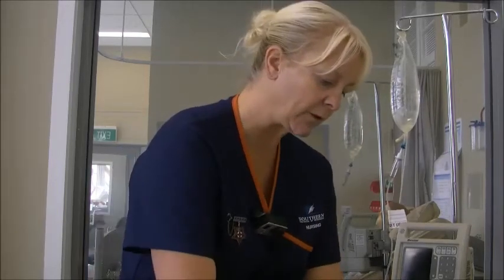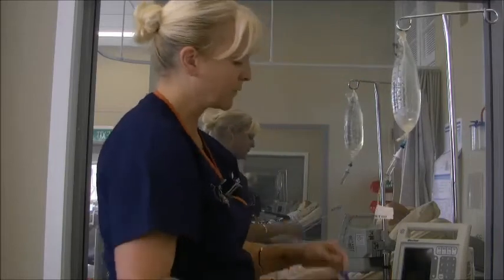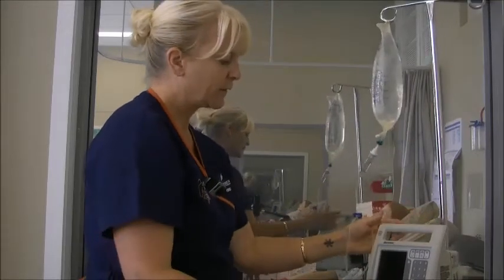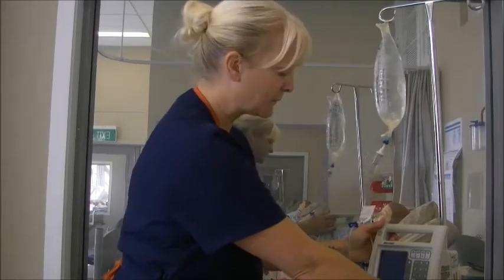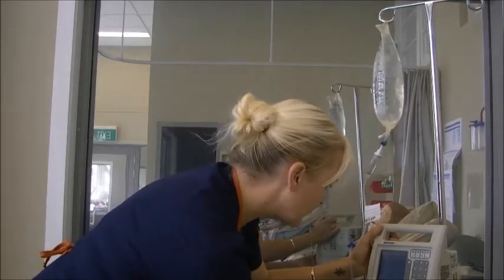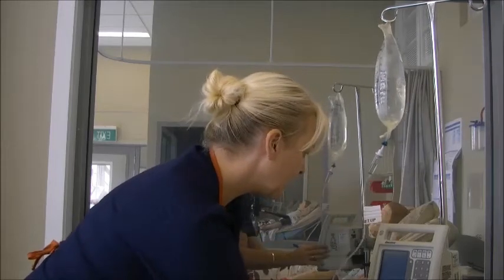So I'm just going to turn those off and make sure that this clamp is off, and then I'm going to connect it to the pump. In the first instance you push the on button, and then it's going to make a loud noise, and what it's telling you there is that it wants you to check the speaker. So you've got to do a speaker test, and then it's going to say, did you hear that?